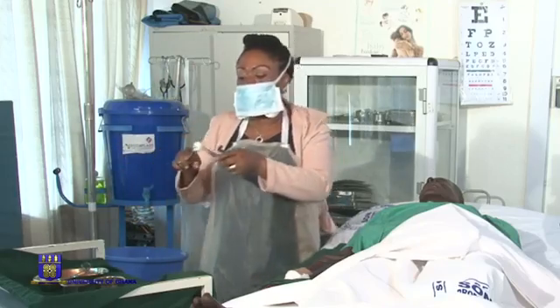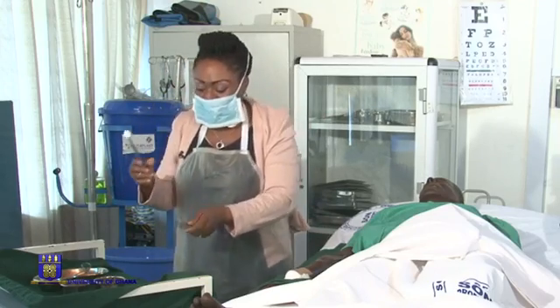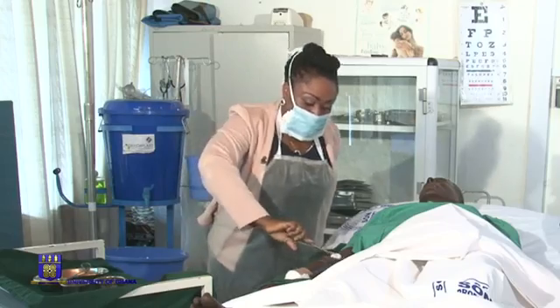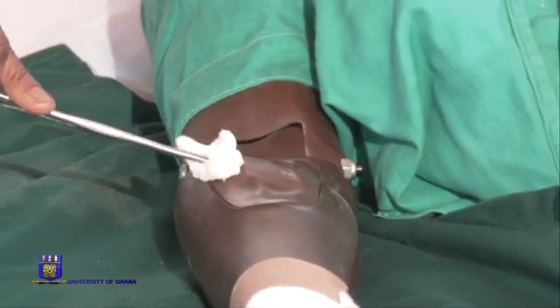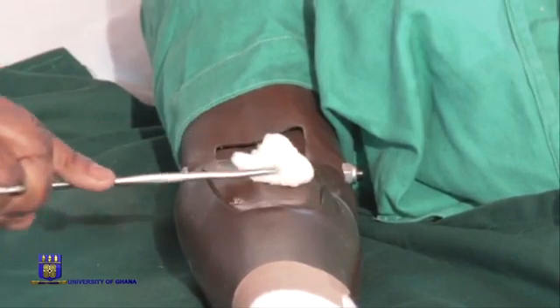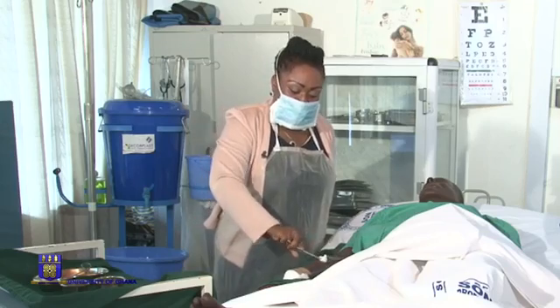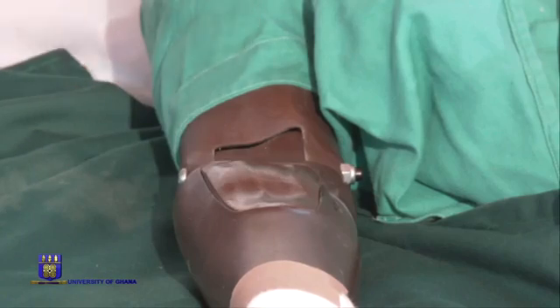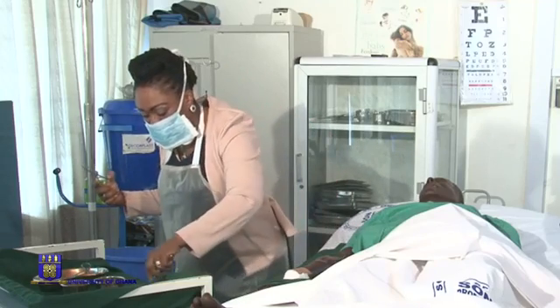Clamp the forceps, making sure the tip of the forceps is covered. Please, it should be firm, but don't sweep the wound and don't also dab. Give it a firm pressure, making sure you clean to remove all dirt and slough.